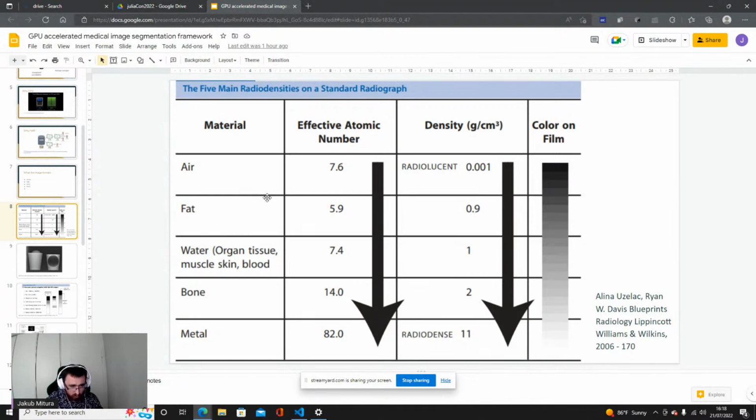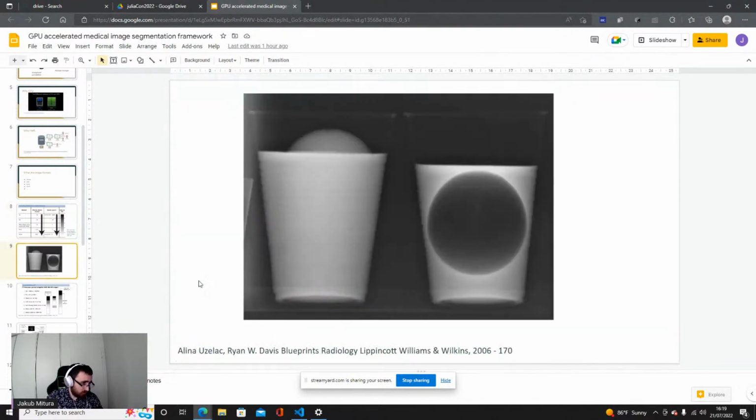What is also important is that you can quantify this property. This radiolucency, or basically how easy it is for the X-ray to get through, in the case of X-rays or CT scans. Different tissues and different substances will have different numbers associated. Because of this, we can easily imagine it as a multidimensional array.